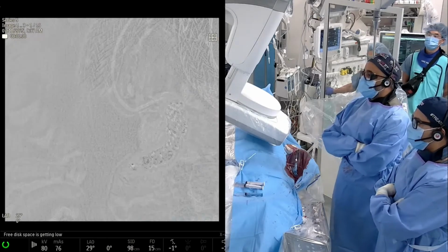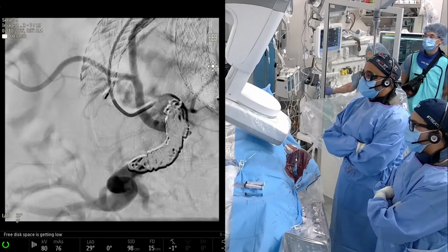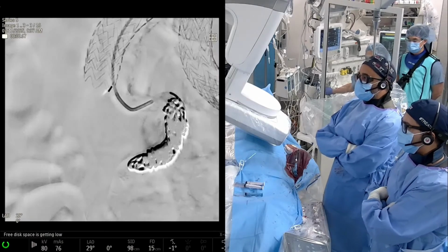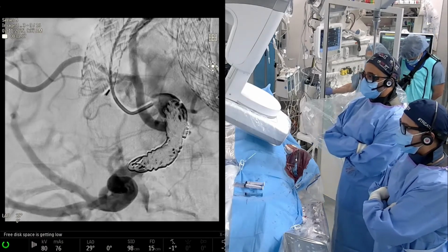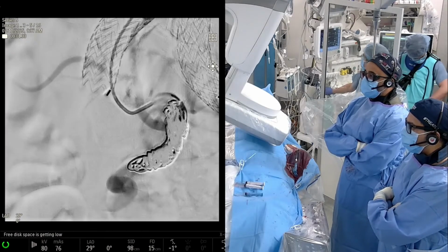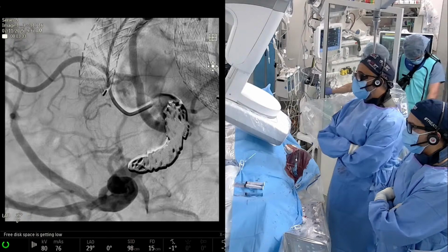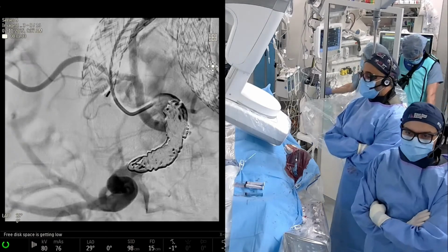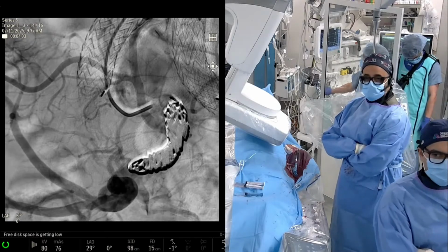So you are going to go with the micro system? Yeah, I think I'm just going to go with the micro system and see if we get lucky and get into this little branch, because I think that's part of what's keeping everything kind of open. But we'll go from there. Yeah, some of it's just patience. You could also make the argument they're going to cover this anyway. Yes, exactly. And that's often what I do.